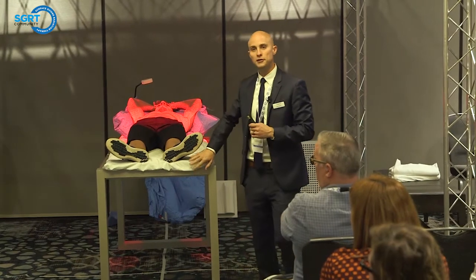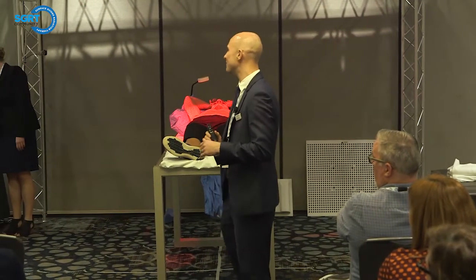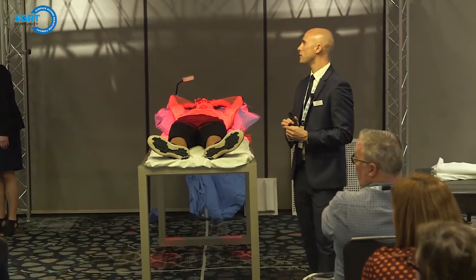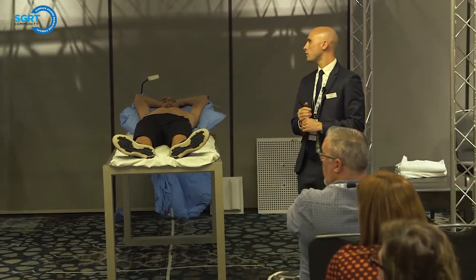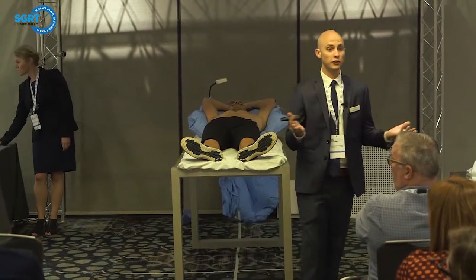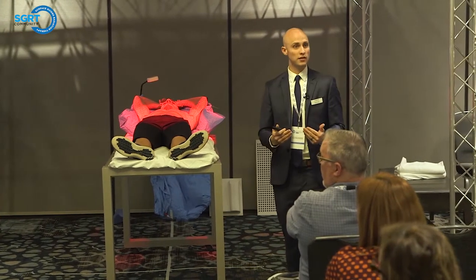This couch is a little limited and doesn't move like that, so we're not going to adjust those today. Once everything is as close to 0 as possible, we can pause monitoring and switch over to our breath hold surface that we achieved from sim. Now once I do that, before we begin monitoring, I would expect at least one of my deltas to be out of tolerance. Which one? Vertical, possibly lat, possibly longe, depending on how that patient is breathing in.